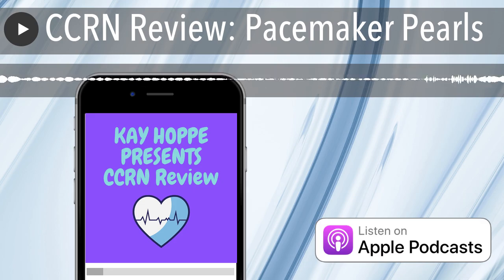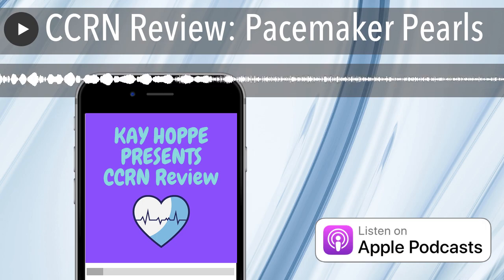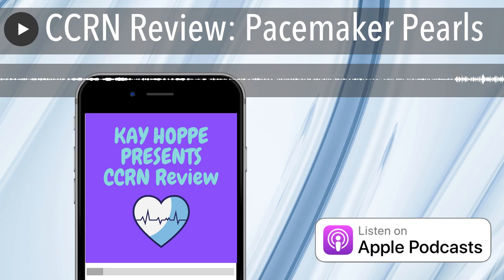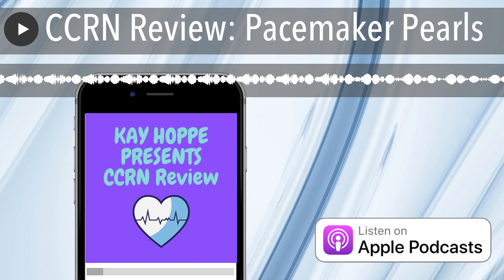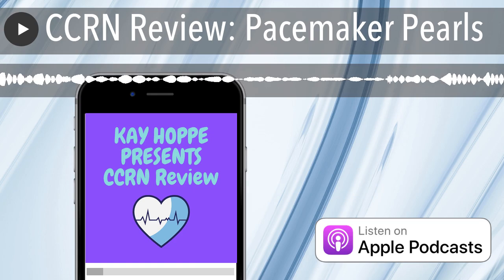And that is when you place a magnet over a permanent pacemaker, you are going to change the pacemaker to an asynchronous or fixed rate pacer. That's what you're going to do. And so it does not turn the pacemaker off. So let's explore in a little bit more detail. Let's explore these pacemaker malfunctions. So what kinds of things can cause failure to pace? Because that's the first one that we talked about.